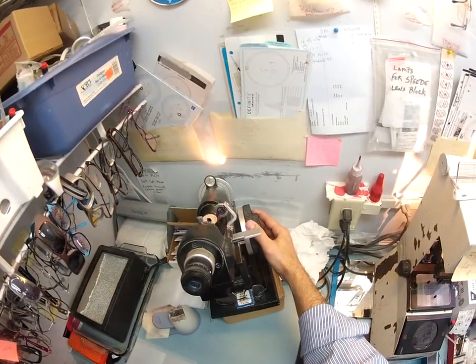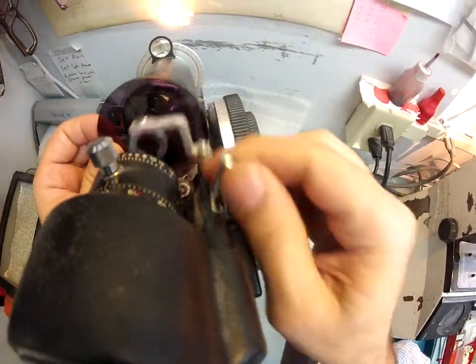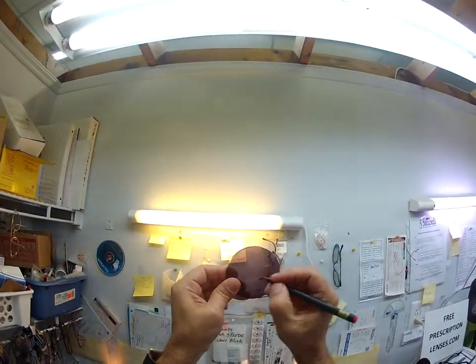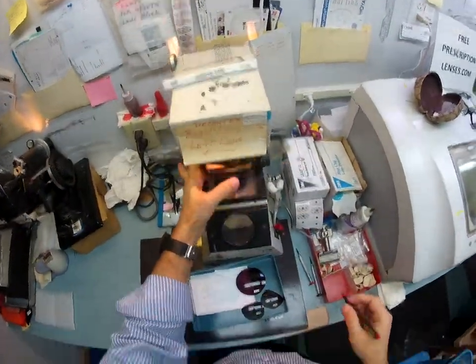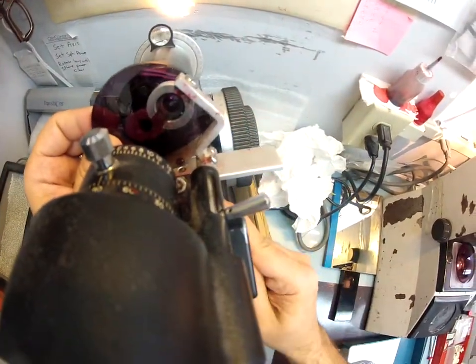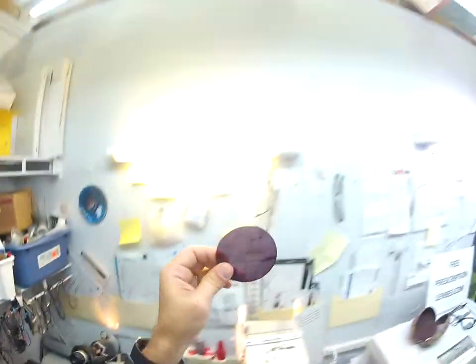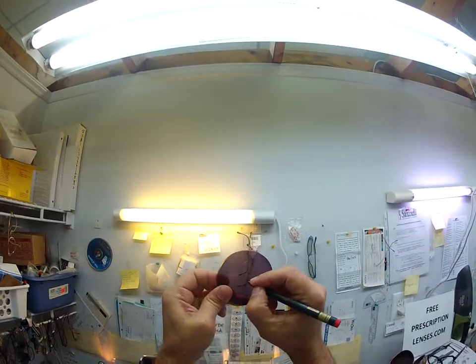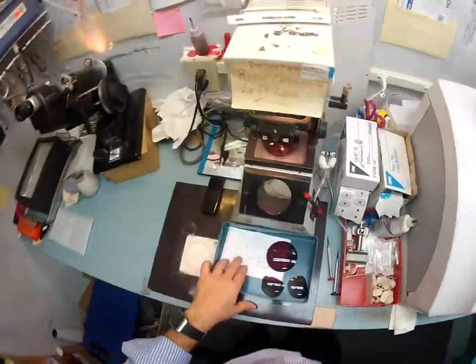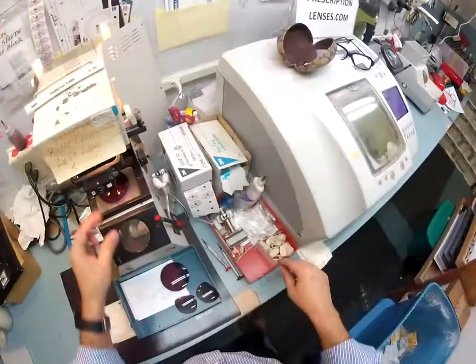This is your right lens, which reads -1.25 sphere, so I'm going to spin the axis wheel on my Marco 101 lensometer, find the optical center of your lens, and put some dots on there. They're too light for you to see, so I'm going to darken them, and then using that horizontal meridian, I'm going to show you how I decenter manually. This is a -1.50. So I'm going to put this in, find the optical center, put some dots on that lens, and label that one left. So your frame PD is 71, your PD is 60, so 71 minus 60 is 11, half of that is 5.5, so I'm going to move your lens 5.5 millimeters over.